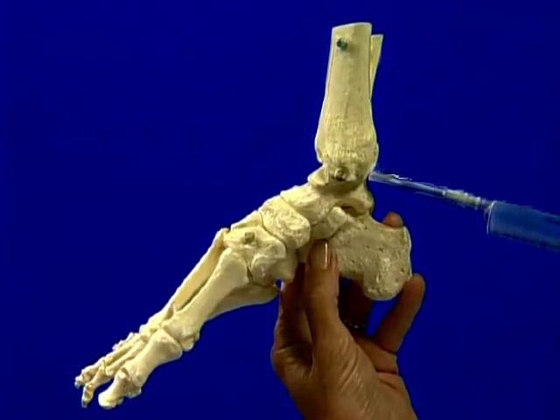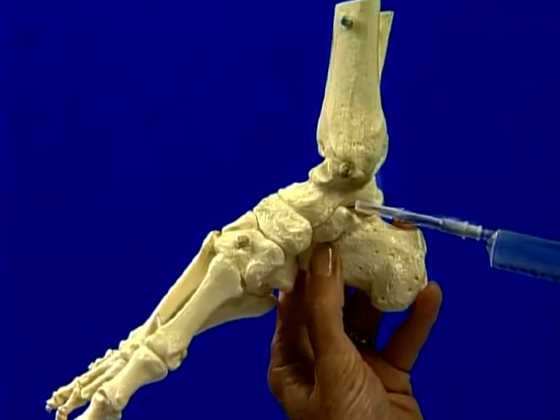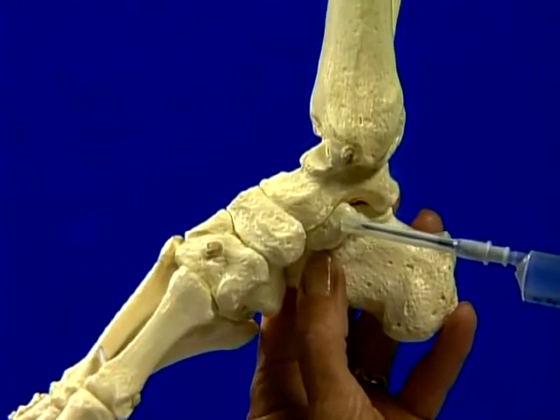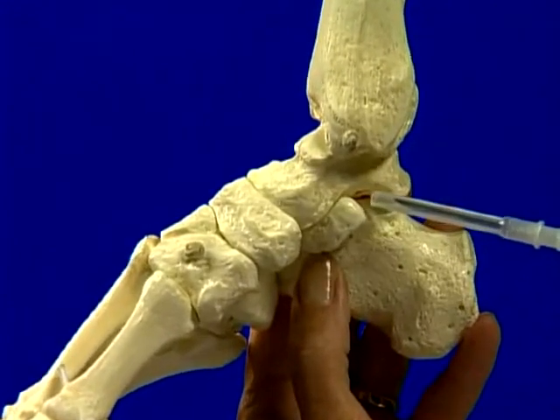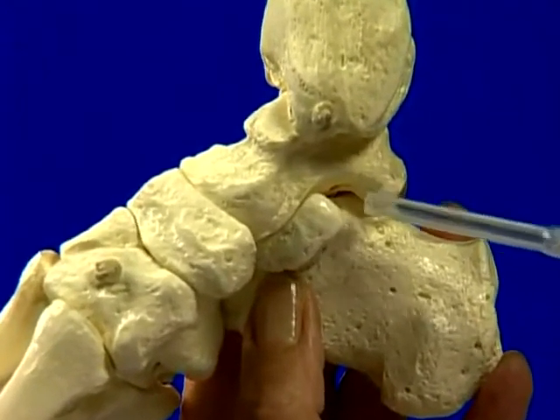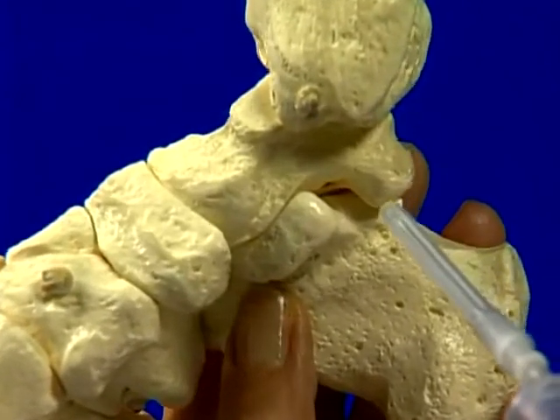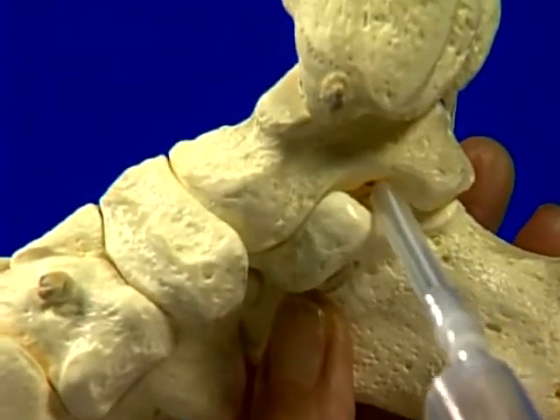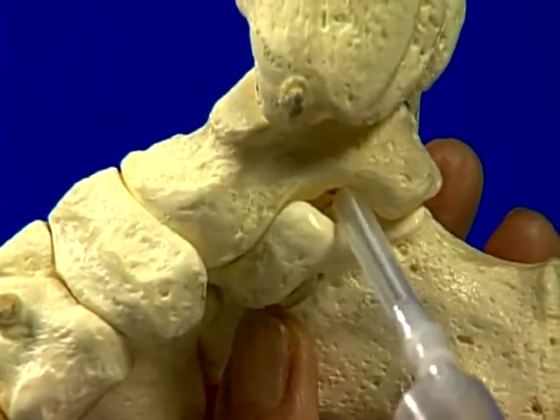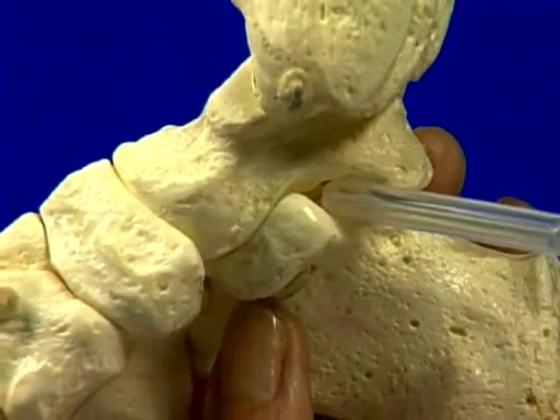Identify the medial malleolus and move down to the sustentaculum talus. Immediately above and slightly posterior is a sulcus. Insert needle into posterior section of the joint, then pass anteriorly through the septum into the front of the joint.